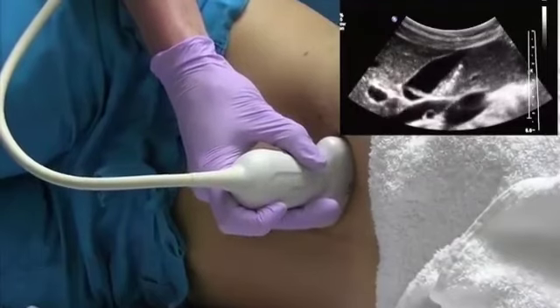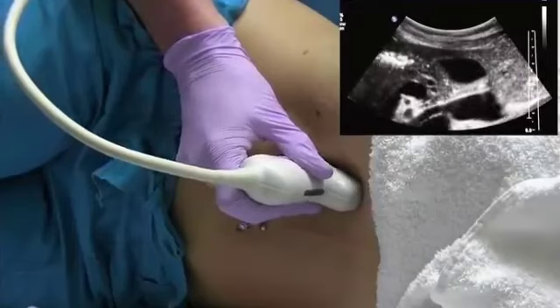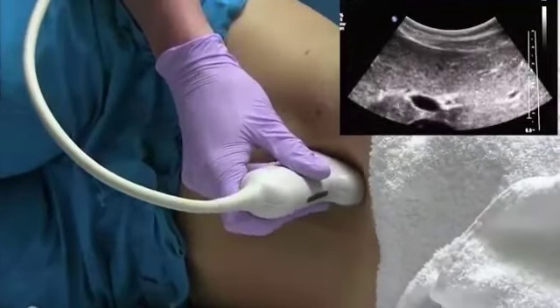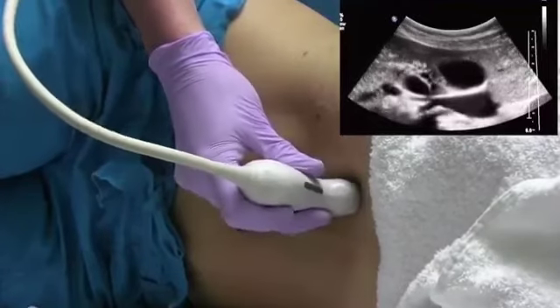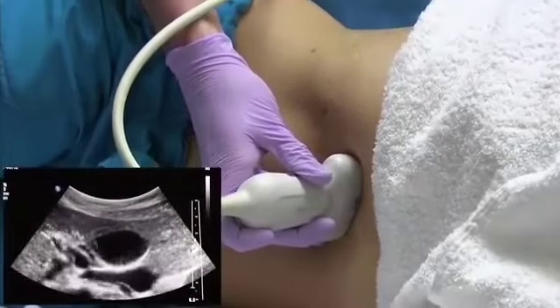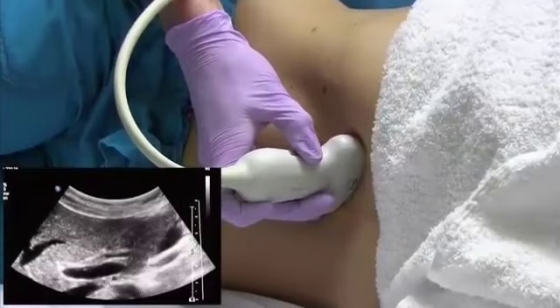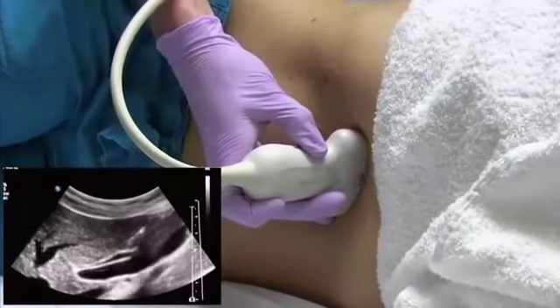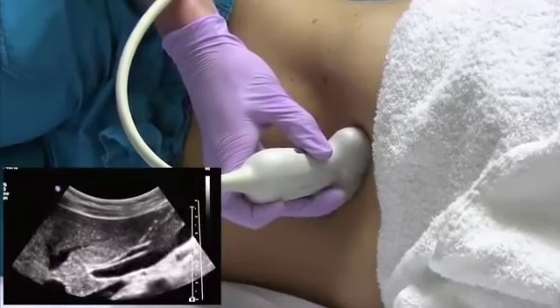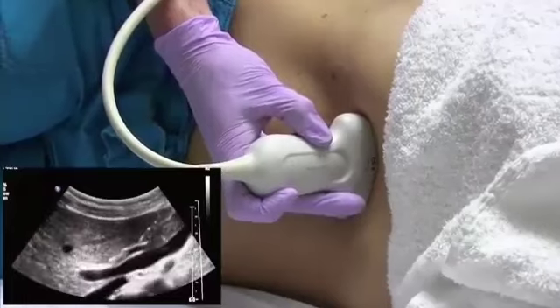Once you get your sagittal sweep, you're going to want to turn your probe 90 degrees again and sweep through in a transverse plane just to make sure you're not missing anything. You can also see the porta hepatis and the CBD from this decubitus position as well. For this, you want to elongate the main portal vein, and you'll see it track right up into the liver.